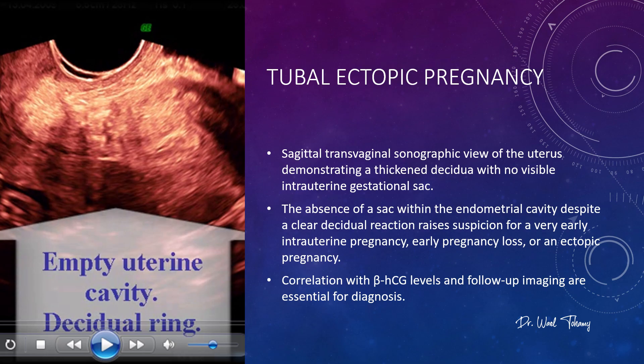Look closely at this transvaginal scan of the uterus. You can see a thickened decidual reaction but no gestational sac inside the uterus. When you have this absence despite a clear decidual reaction, think of three possibilities: very early intrauterine pregnancy, an early pregnancy loss, or an ectopic pregnancy. Always check the beta-HCG levels and plan follow-up imaging before making the final call.